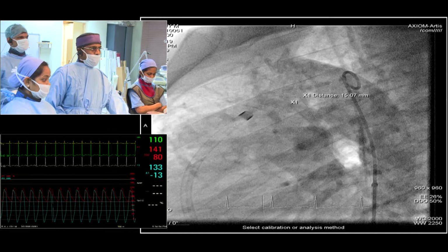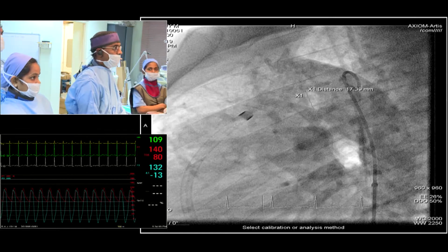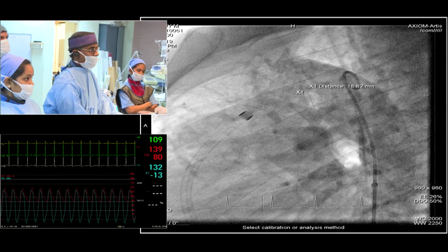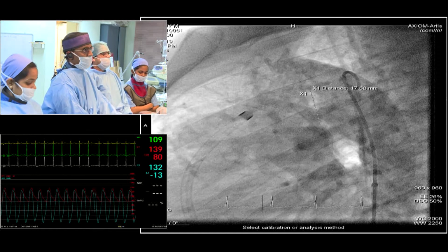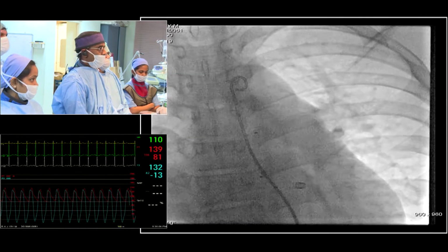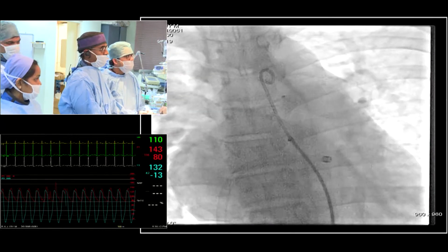Who else is doing PDA interventions in the audience? Raise your hand. Perfect. Who is this up front? Freeze it. Aha. Enough. Let's see. Okay. So from your standpoint, you're just walking in? Jesse, you want to summarize what we've got so far and where we're at?